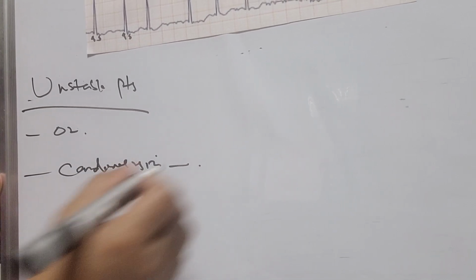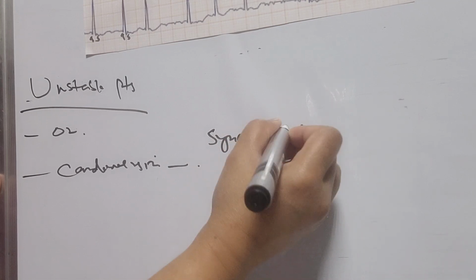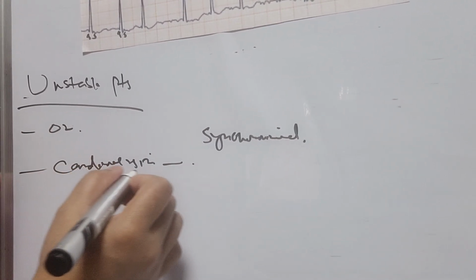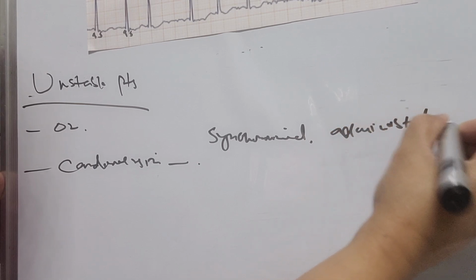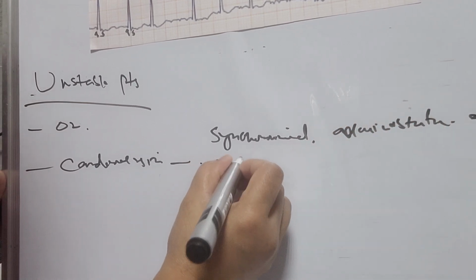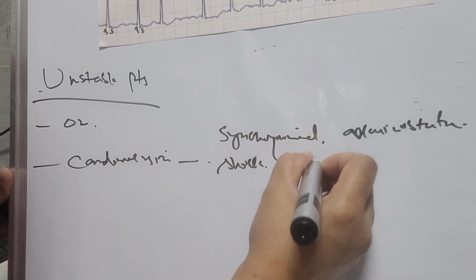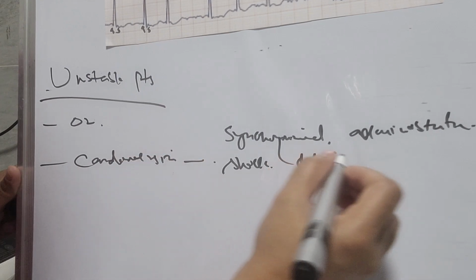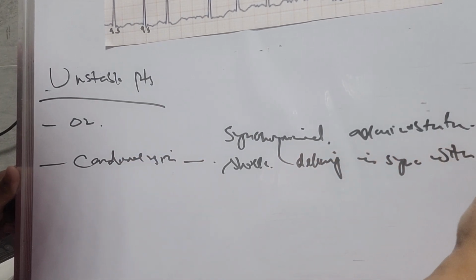The synchronized administration of shock delivery in sync with the QRS wave.